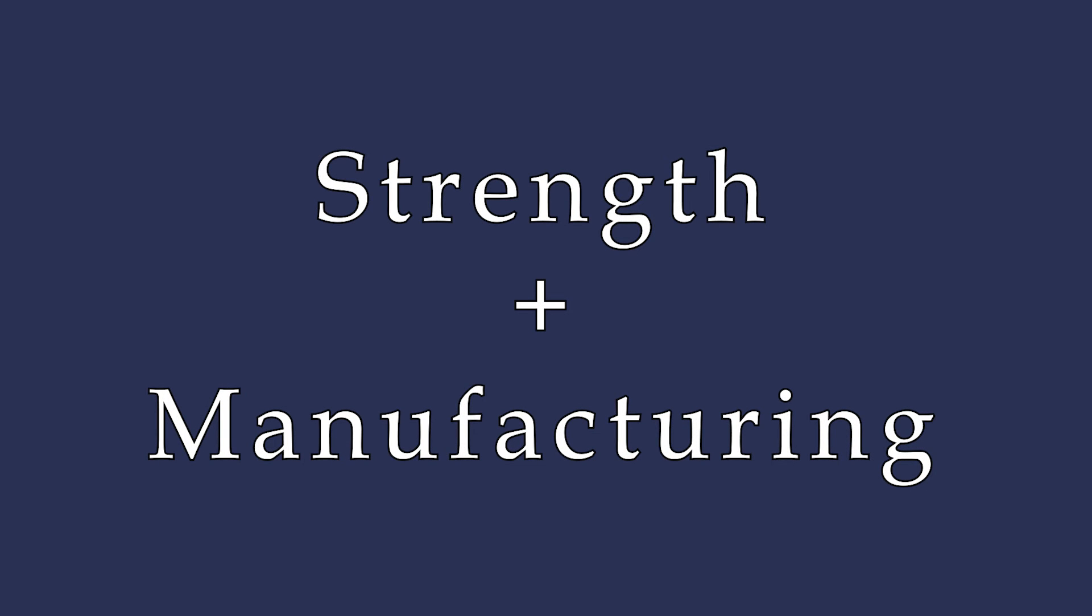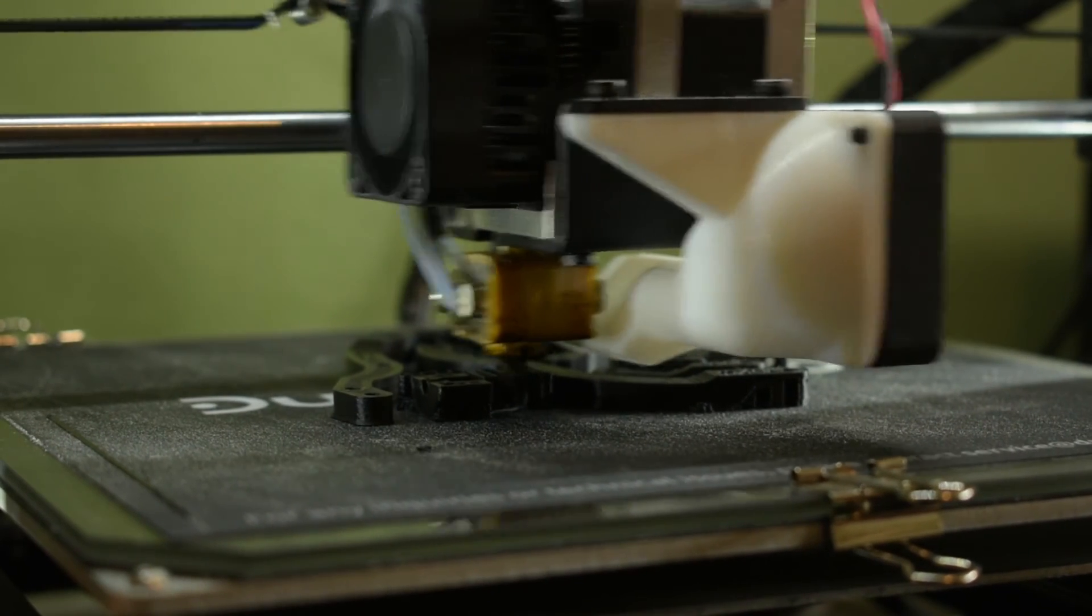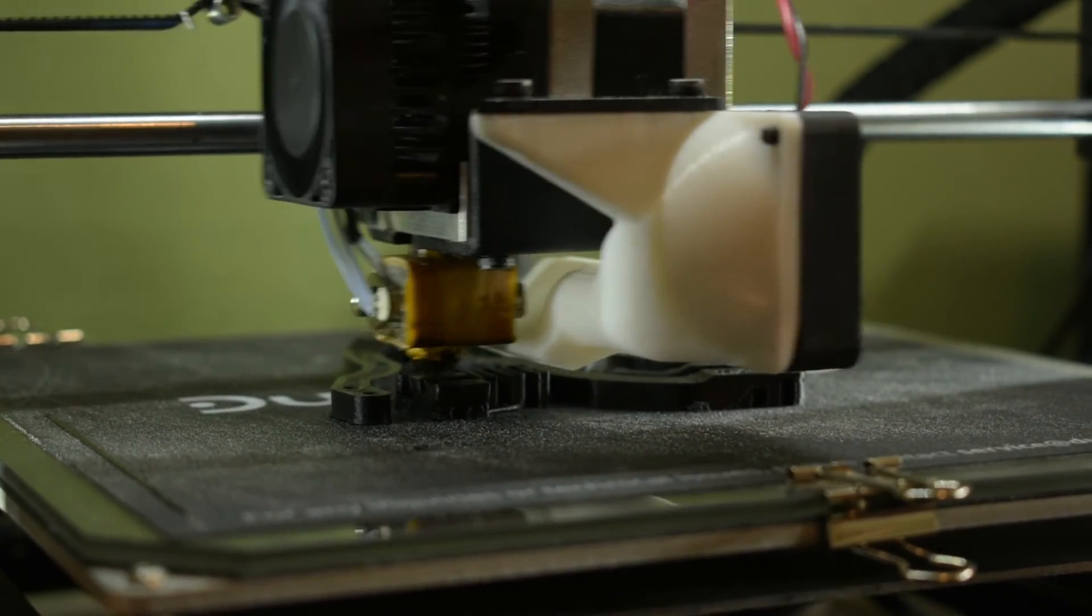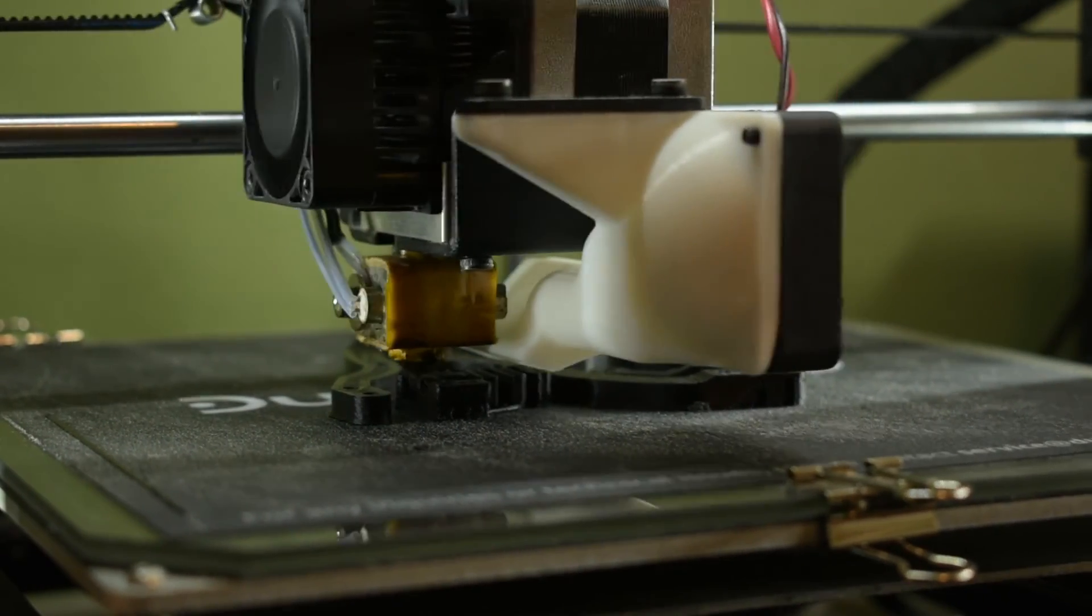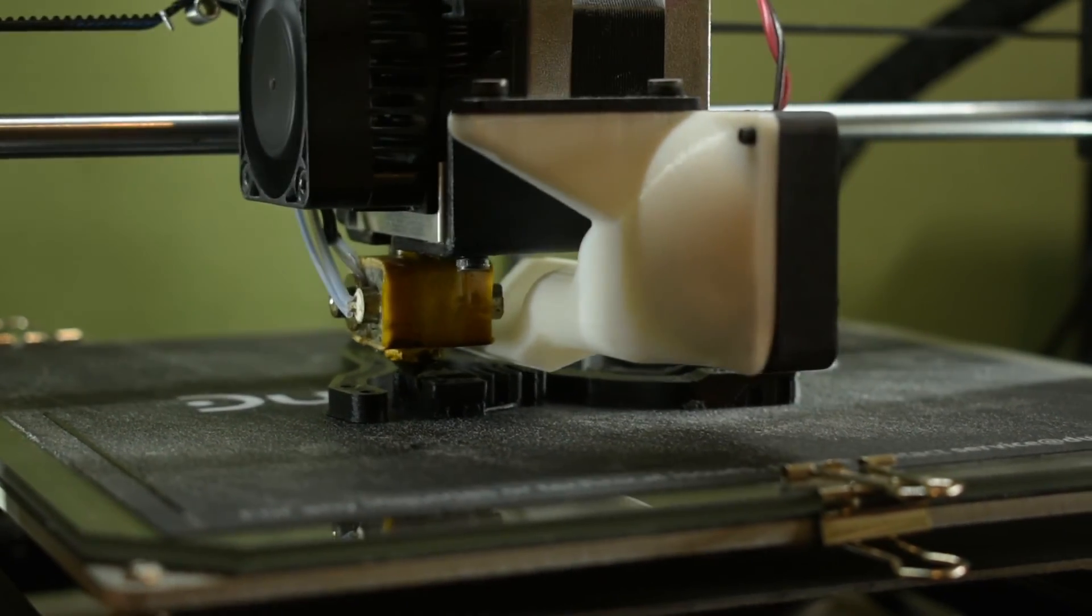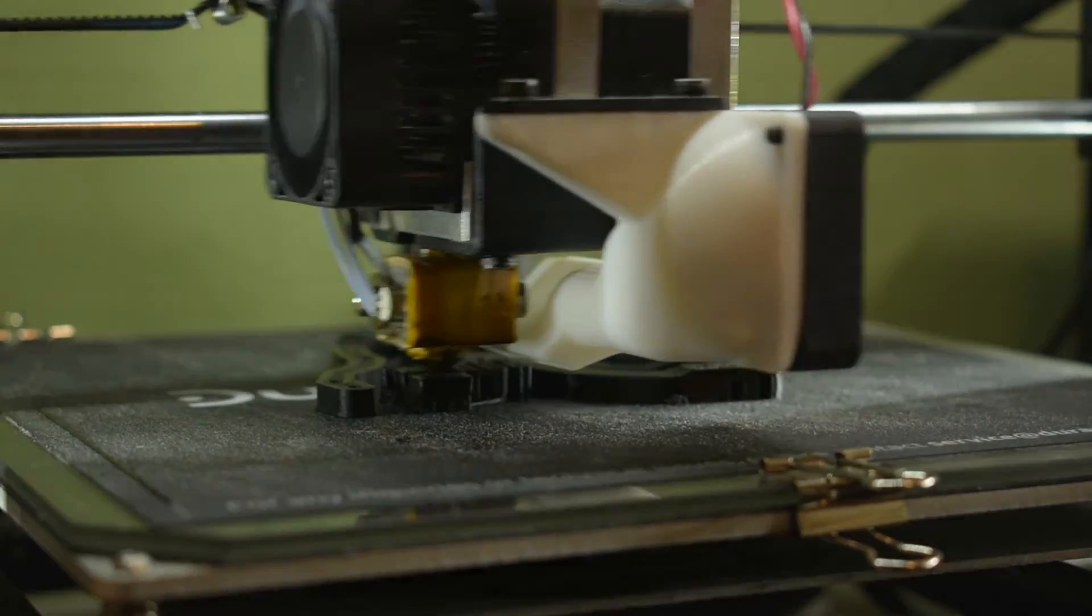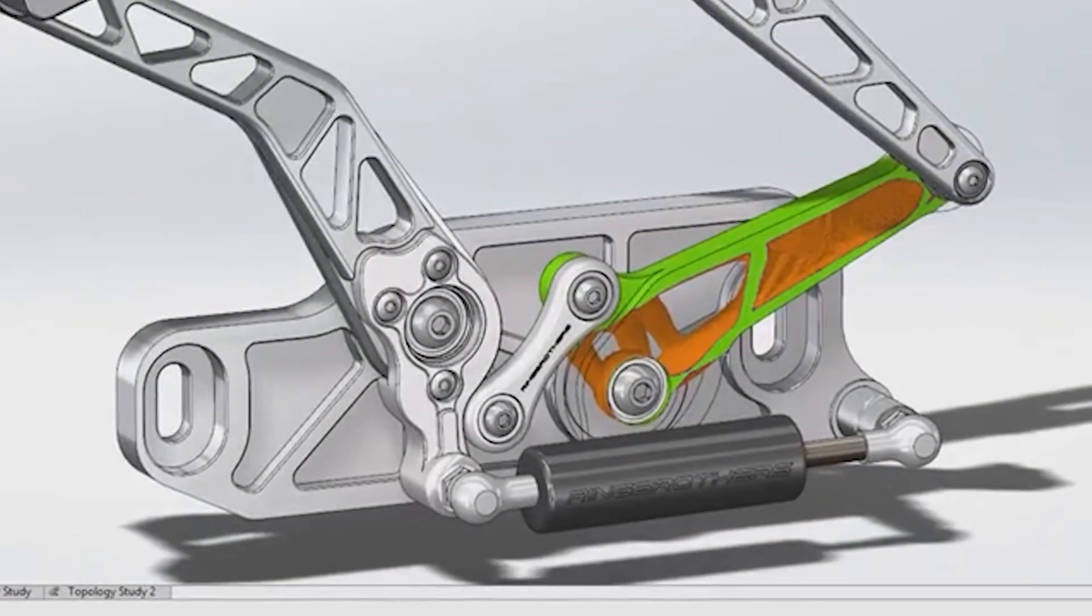Geometries of the finger itself could also be further optimized for both strength and manufacturing. In its current state, the finger requires a considerable amount of support material that could be eliminated with some design changes, and using tools like topology analysis could make the finger both lighter and more durable.